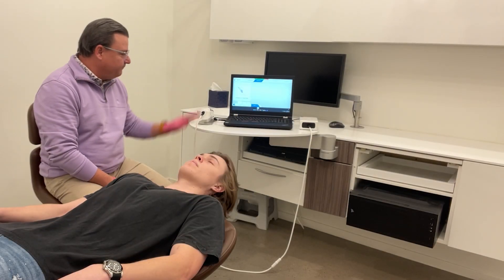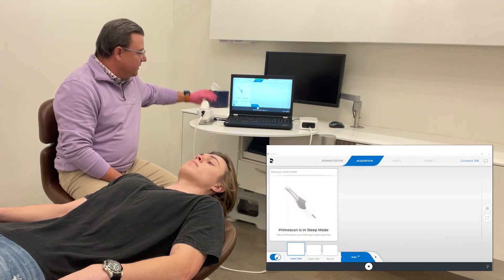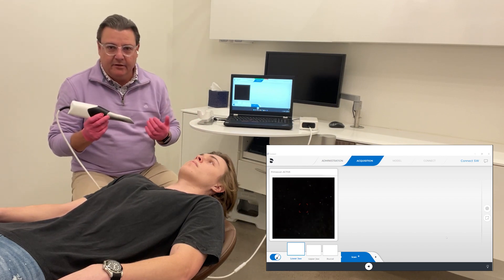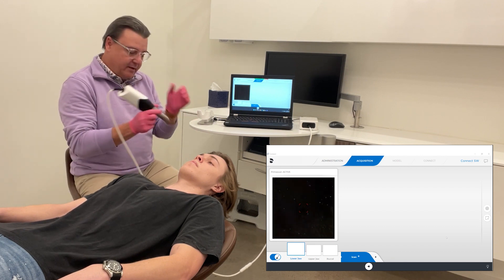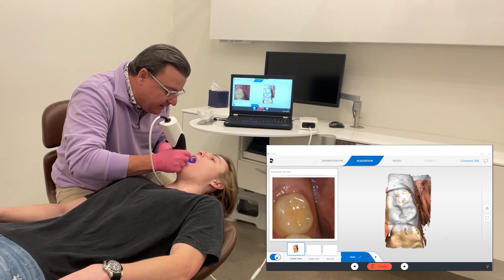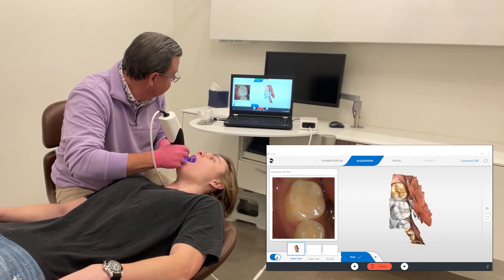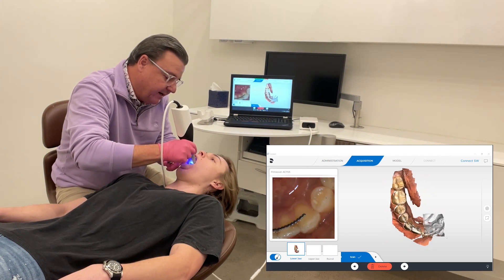First thing we're going to do — the PrimeScan is in sleep mode right now, so all I have to do is pick up the scanner and it will initiate and come on. Just like the other PrimeScan, it's got a built-in heater so we don't have to worry about fogging or any of those things. So I will have Colin open. I have my audible feedback letting me know that I am scanning.